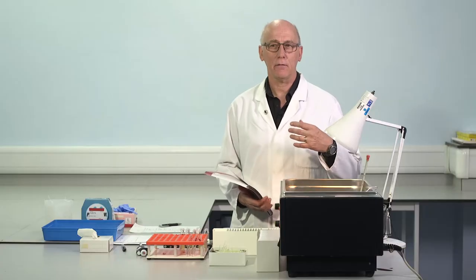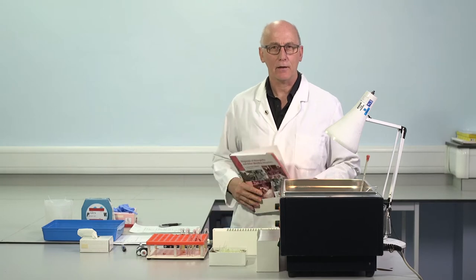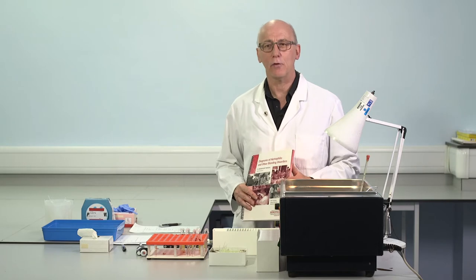So I think there is increasing interest, and we'll talk in the next 30-40 minutes or so about the way in which the activator can have an impact on the results that we obtain. The full protocol and some comments related to APTT are contained in the World Federation of Haemophilia Laboratory Manual.